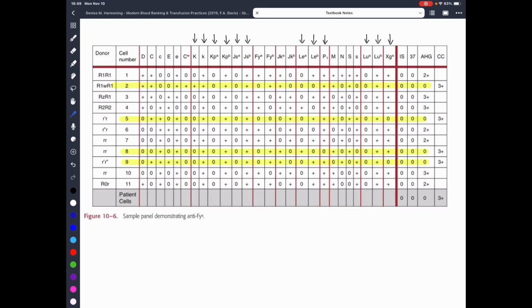And so let's get into the actual crossouts. I highlighted the rows that are 0 reactions. So no agglutination was observed, meaning all of the antigens in all of these reagents do not have antibodies against them in the patient's serum. So let's see what antigens are present in these reagents as either homozygous or heterozygous. And whatever those antigens are, we can say the patient does not have antibodies against all of them. And so those are our rule outs.